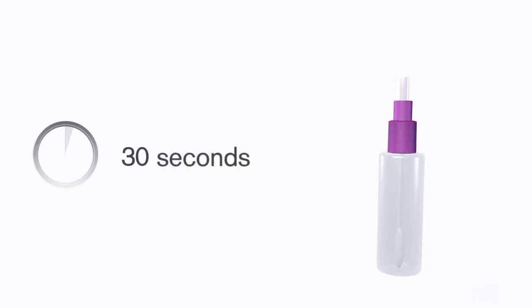Place the swab back in the vial, screw it tight, and shake the vial for about 30 seconds. Take out the swab. Now place the collector of the drug test cassette into the opening of the vial.